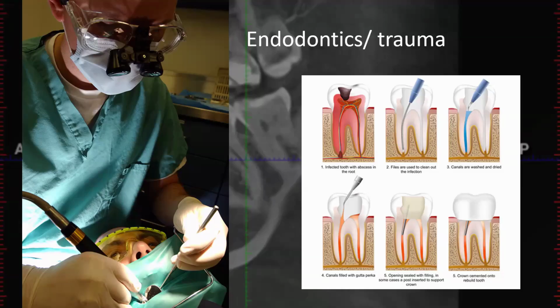Intraoral radiography, you can see fractures, but it has to happen to line up perfectly with the X-ray beam. And so it's going to miss it in most cases. So when we're looking for tooth fracture, mostly what I'm looking for is signs of fracture by bone loss around the root. Have you been taught that J-shaped periapical radiolucency? If you have the lucency of the apex, but then also creeping up a side, in intraoral radiography you can only see it on the mesial or distal surface of the root. That's one of your key indications of a potential root fracture.